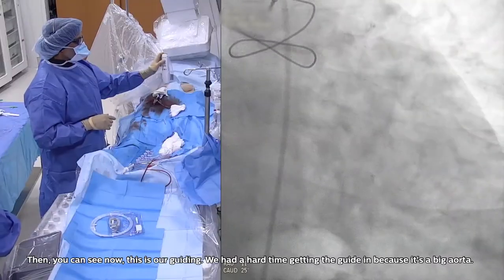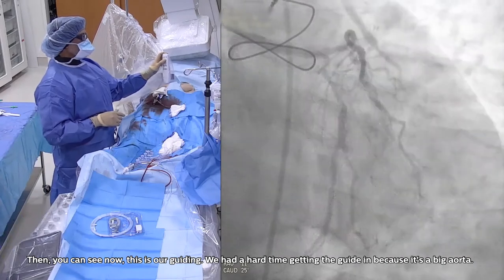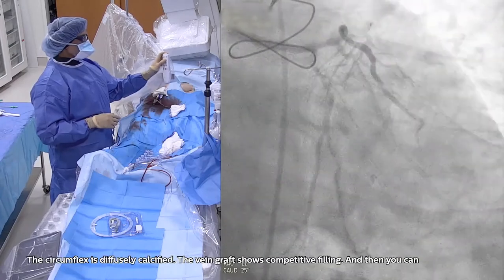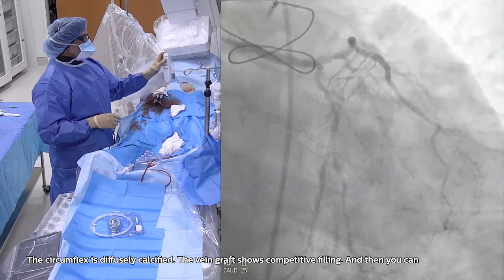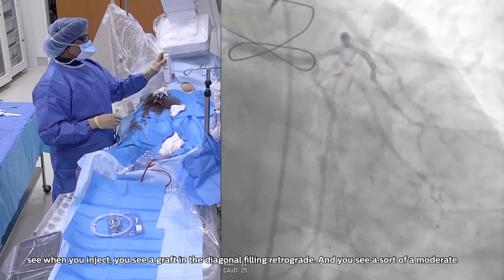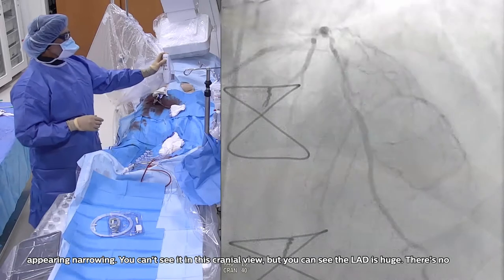And then you can see now, this is our guiding shot. We had a hard time getting the guide in because it's a bigger aorta. So you can see calcified arteries before we even inject. The circumflex is diffusely calcified. The vein graft shows competitive filling. And then when you inject, you see the graft to the diagonal filling retrograde, and you see a moderate appearing narrowing.